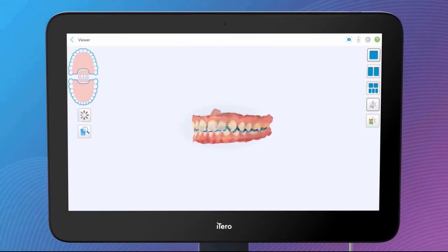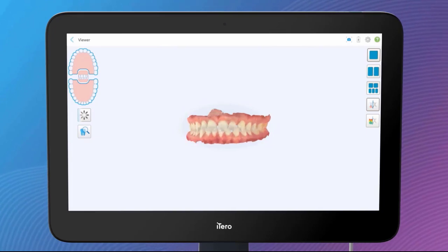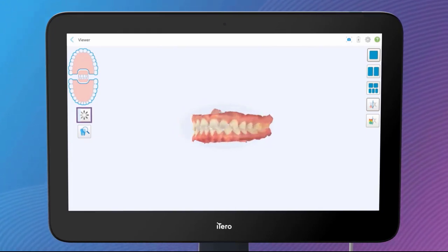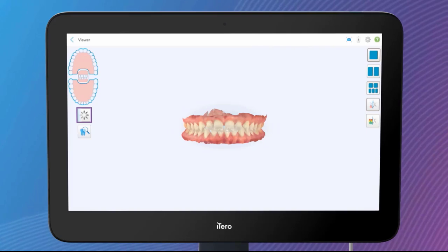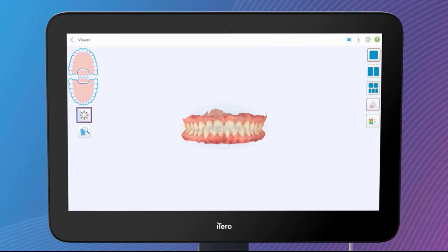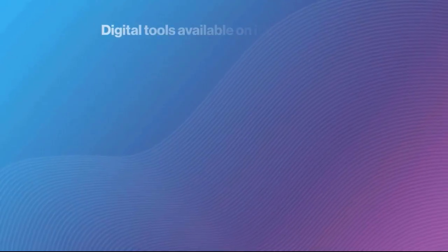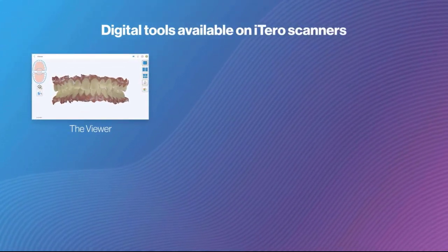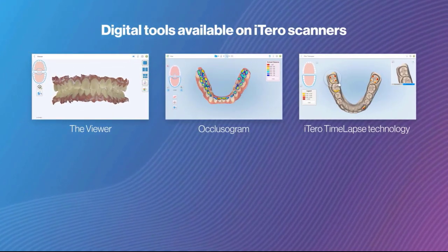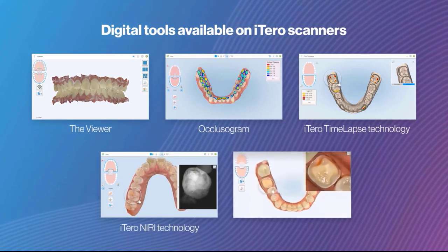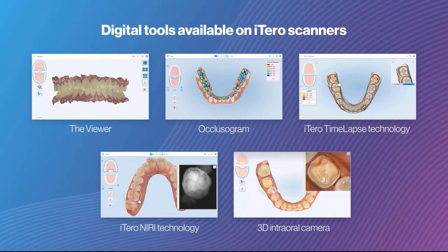The viewer opens and displays the scanned 3D model. The simulation takes approximately five minutes to calculate. Calculation progress is indicated by the Invisalign Outcome Simulator Pro button. While the simulation runs, you can use all the other iTero digital tools, including the 3D Model Viewer, Occlusogram, Time Lapse Technology, iTero NIRI Technology, and the 3D Intraoral Camera.